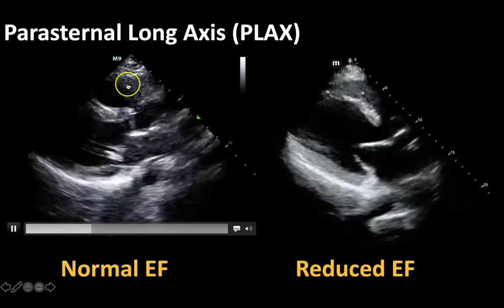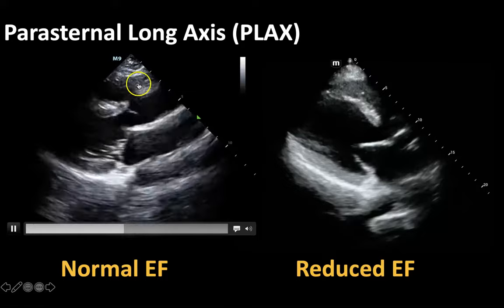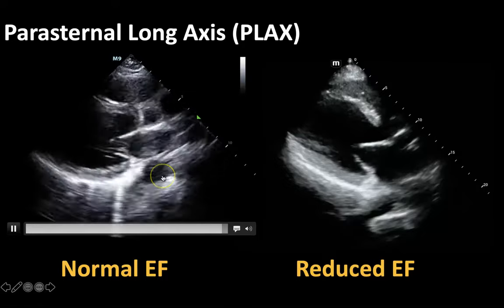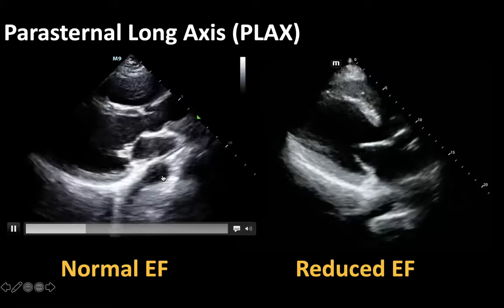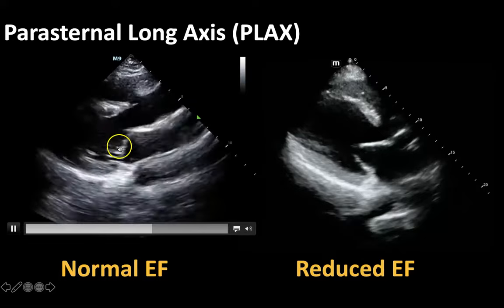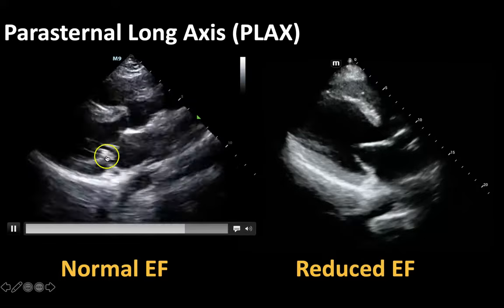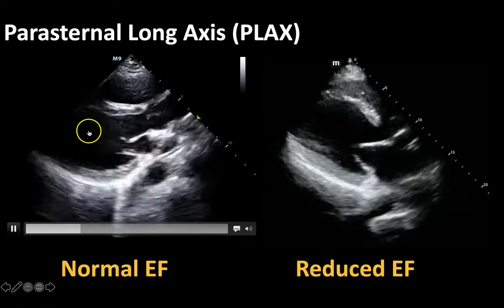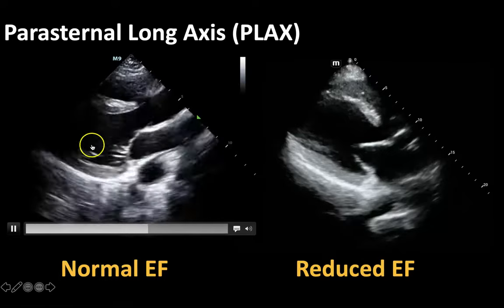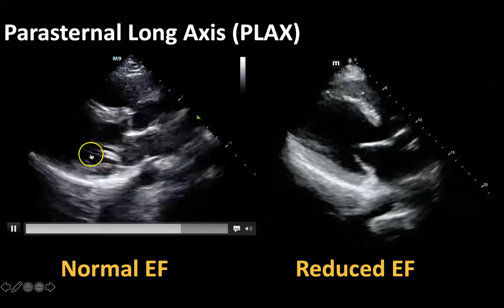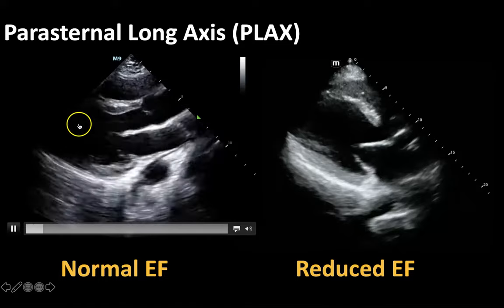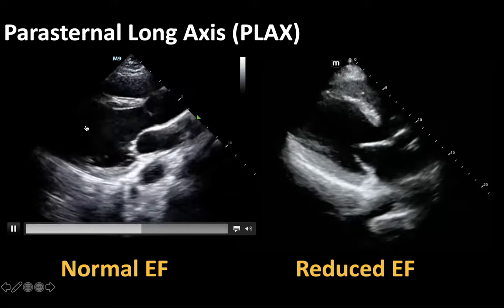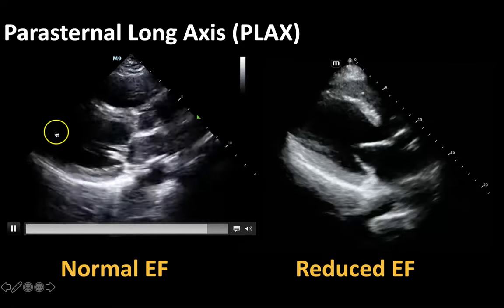This most superficial structure is going to be your right ventricle, and back here is your descending aorta. When you're assessing for ejection fraction, I really want your eyes to focus on the left ventricle. What I like to do is draw an imaginary line in the middle of the ventricle and picture how close the walls are coming towards the middle to see how well the chamber is emptying during systole.